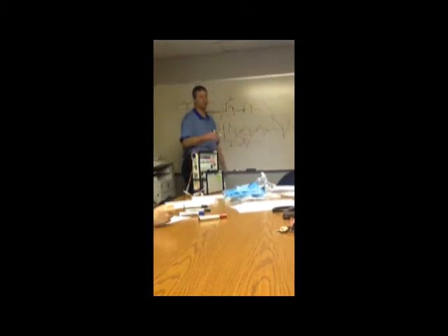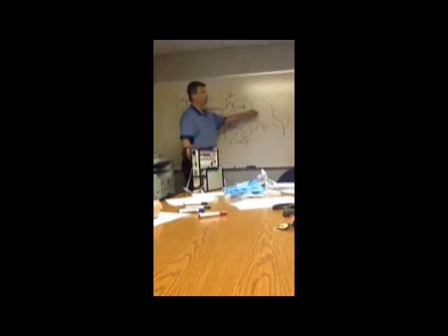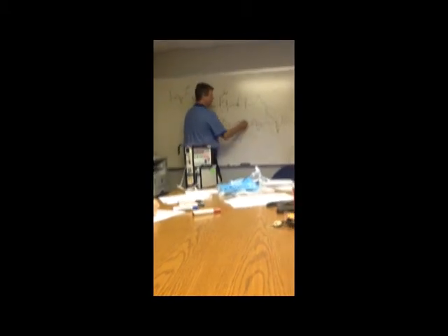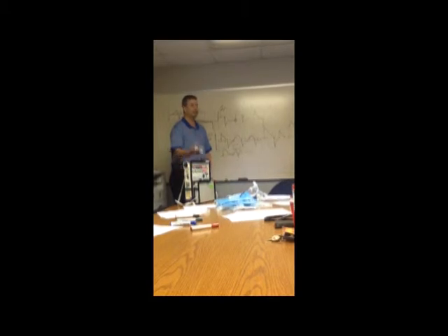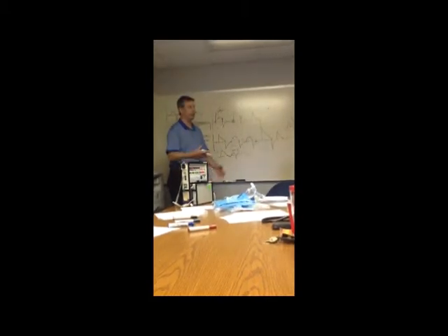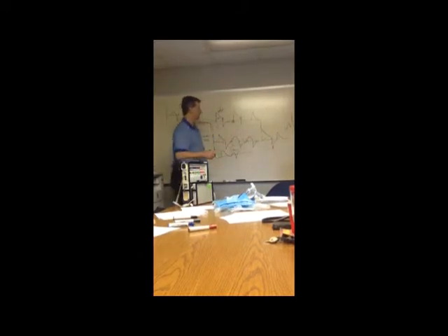If they're doing bad, don't bother with trying to increase the pressure support to take the work away from their spontaneous breath and relieve their work of breathing that way. Switch them to assist control. Let the machine do everything. Because if you go up to 15, it's doing more of the work, but you don't know that it's doing 100%. You're still having to suck in to get it going and all that.